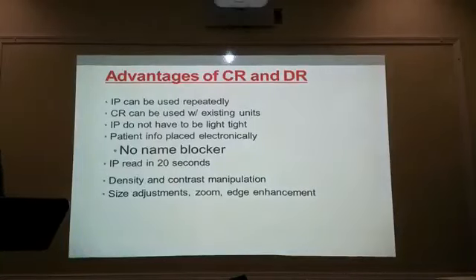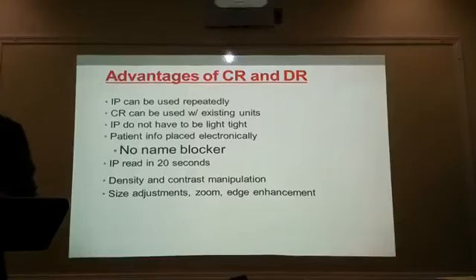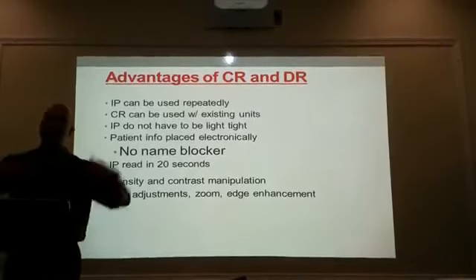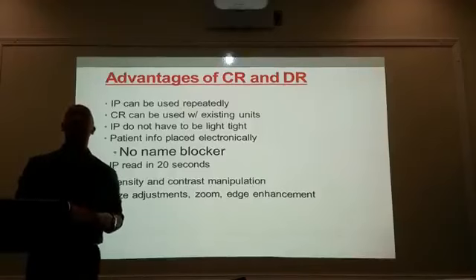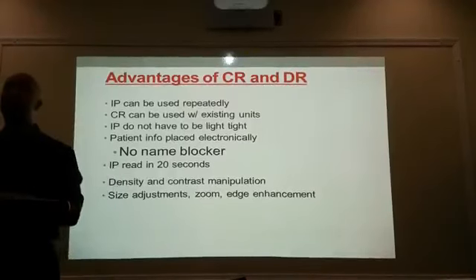Okay, so the difference then, advantages between computerized radiography. Here's a new term, DR. What does DR stand for? Direct radiography. Oh my goodness, how do you know that? Okay, it's direct radiography. It's not digital, it's direct. You're absolutely correct. DR stands for direct radiography.